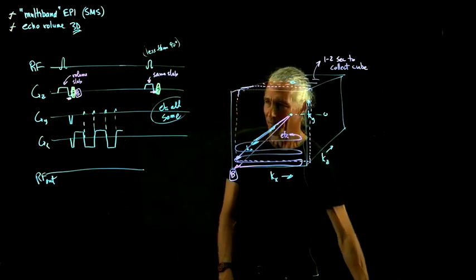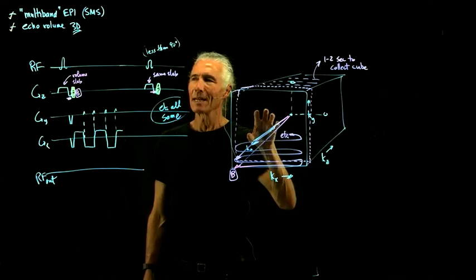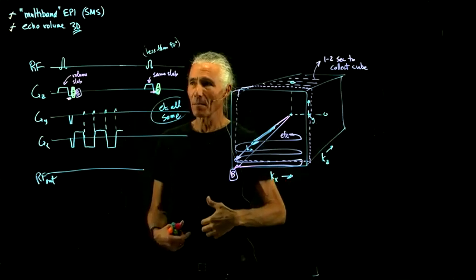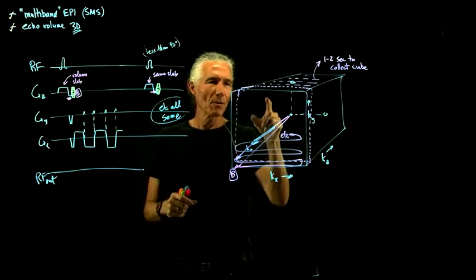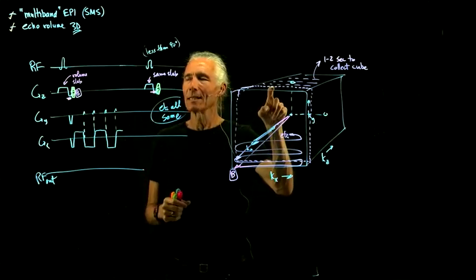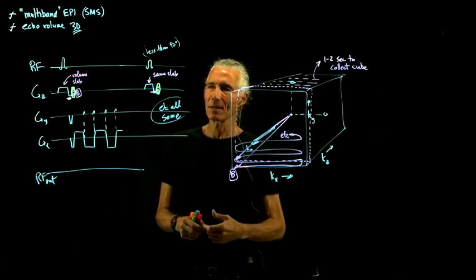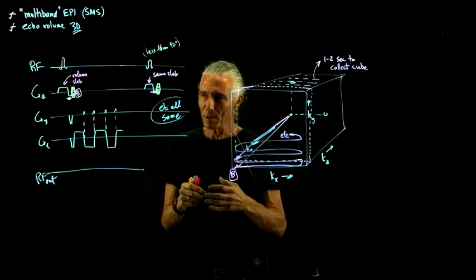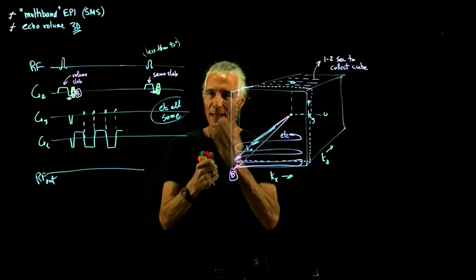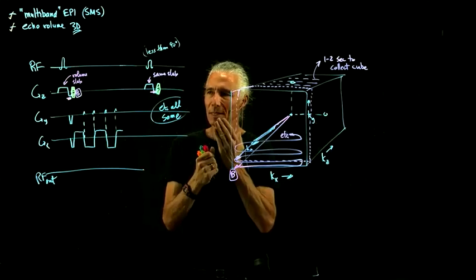But why don't people use it? Well, the problem is that you could move in between, for instance, even something like the heartbeat. The heartbeat will sort of cause the brain to pulse a little bit. And so when we record the next slab of k-space, some movement will have occurred. And that's going to cause artifacts in the reconstruction and start to kill your signal to noise. And so one of the reasons that's prevented people from using this is that with regular EPI, the slice is collected just in an instant, like less than 1/10 of a second. And so movement isn't as much of an issue.